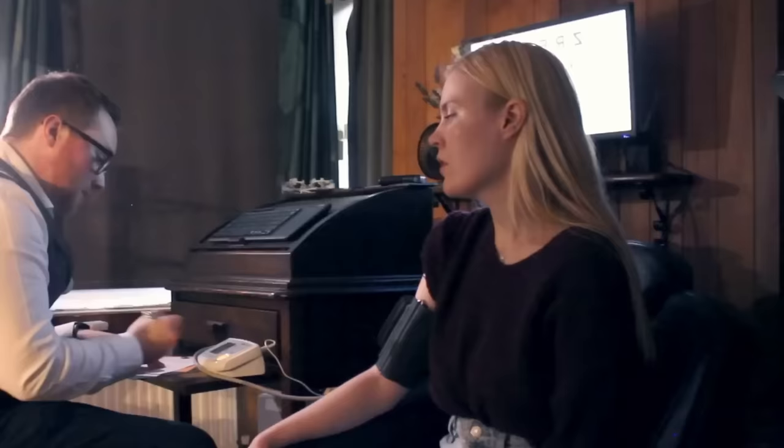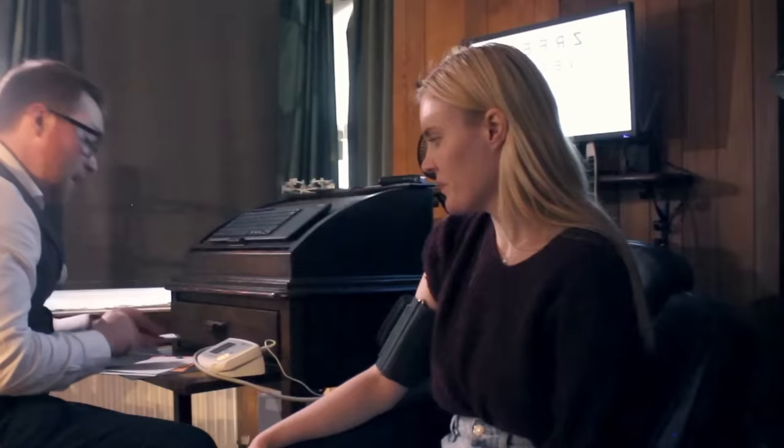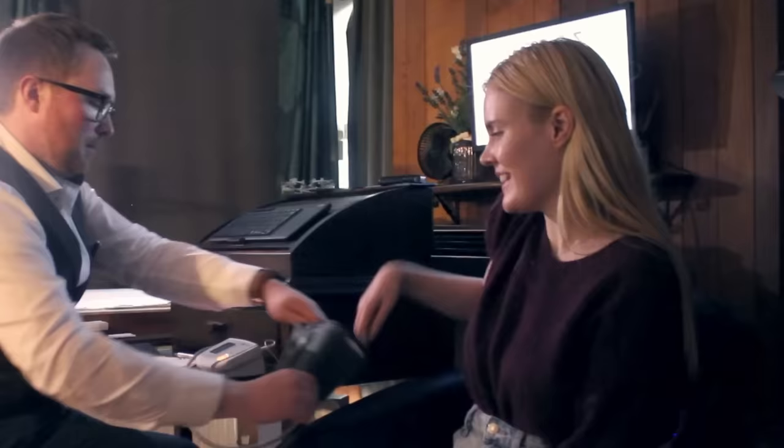So yeah, it's come down a little bit actually, it normally does. Our first reading is normally high, so this one's 90/62, so there's a little bit of a drop there. 69 beats per minute, so that's fine. But it's something to be mindful of. It's not really a thing to worry about at your age. But when you hear of people having falls and they've suddenly stood up, it can be because of this postural hypotension.